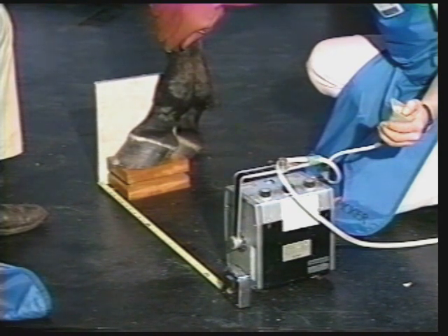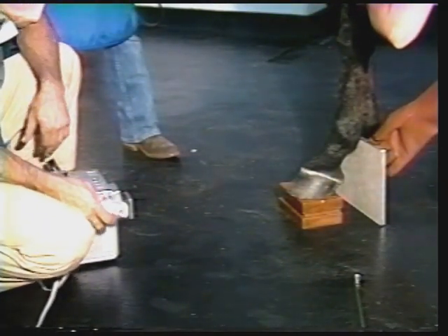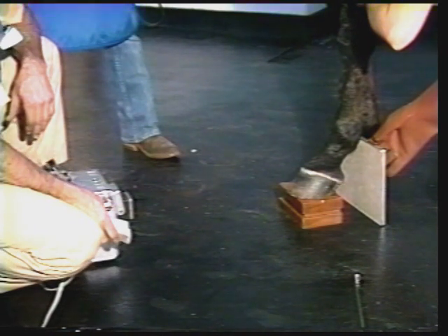You must line the machine front to back, top to bottom, be in the same plane, and you will get a consistent true lateral each and every time. Then the block is turned crossways, so the wire is now transverse to the axis of the horse. I shoot my straight AP, looking for medial lateral imbalance in relationship to the ground. Side bones and other problems can be diagnosed this way as well. The technique I'm describing here is a very detailed, consistent way that you can take radiographs each and every time in any condition and be consistent.